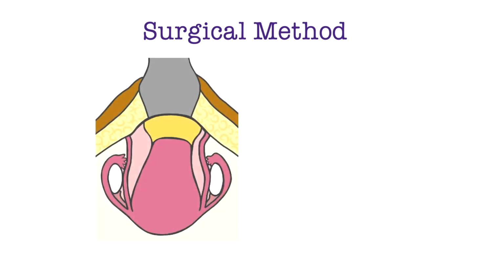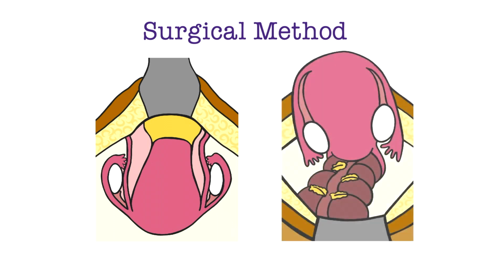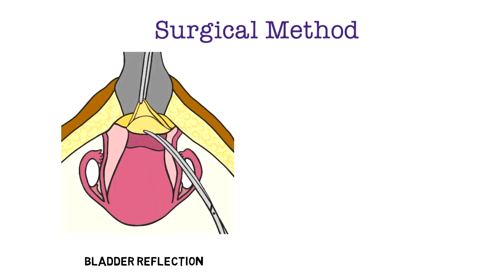Now we are going to briefly discuss the major steps of abdominal cerclage placement. The steps, once in the abdomen, are the same whether performed via laparotomy or laparoscopically. Pictorially, we will show an abdominal approach. Note the bladder is anterior to the uterus, and the rectum and sigmoid colon lie posteriorly. First, a bladder flap is created to help expose the isthmus and protect the bladder from injury.